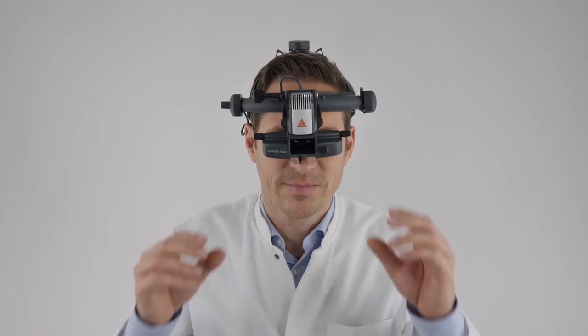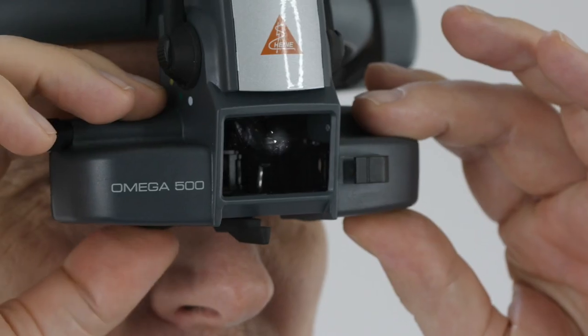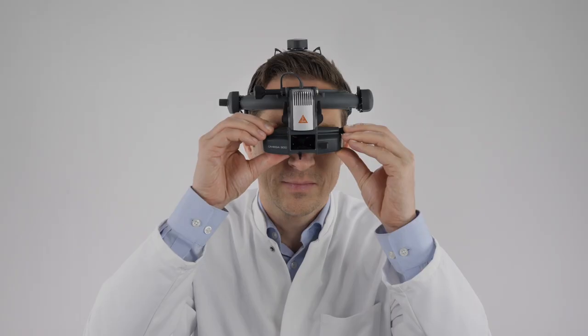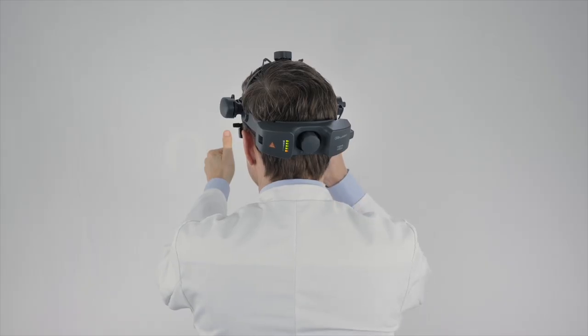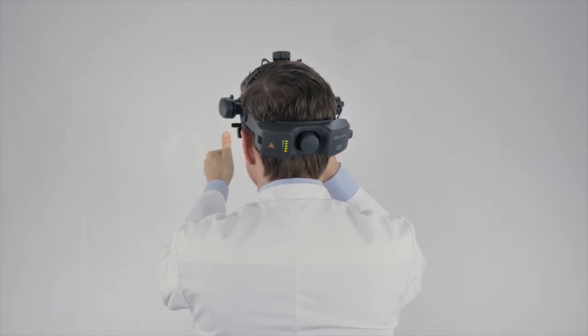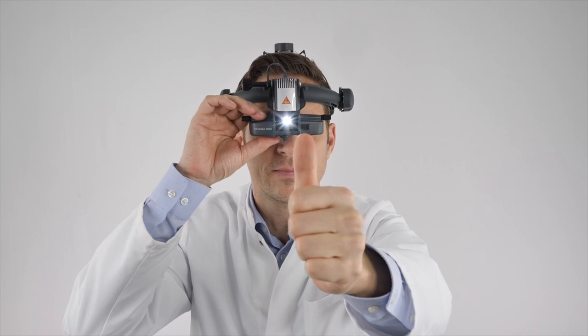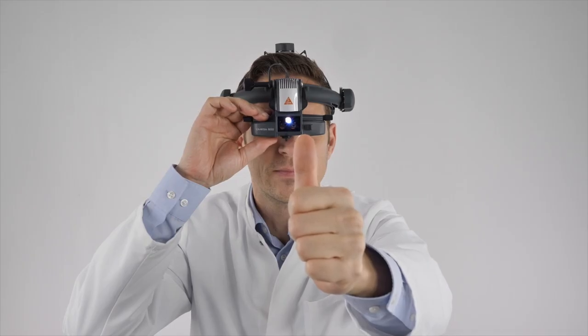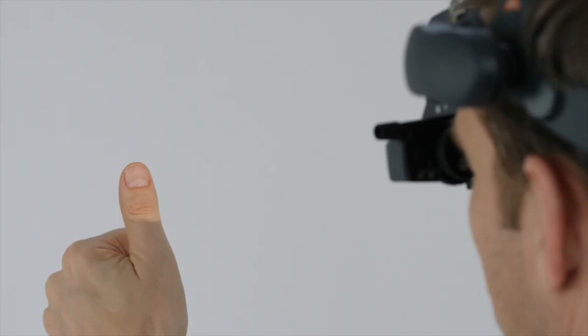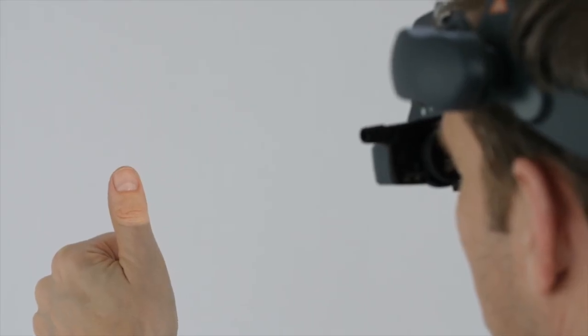Next, adjust the pupil distance. To do this, look at your thumb in the light spot, alternating with the left and right eye, and move the corresponding eyepiece so that the object appears exactly in the center of your field of view. Then use the left or right small knob to align the optical unit so that the light spot appears centered vertically in the view.